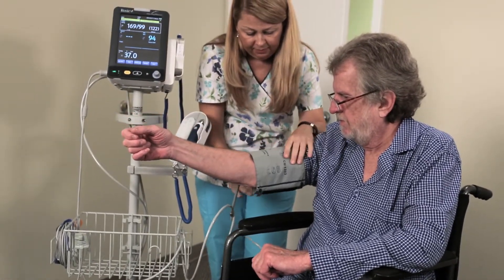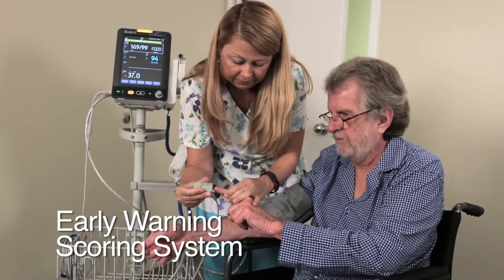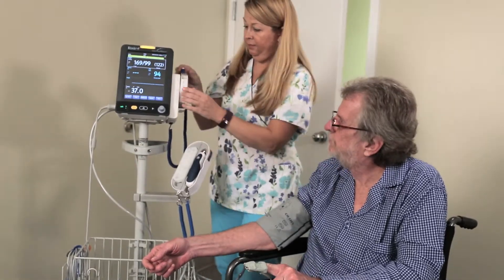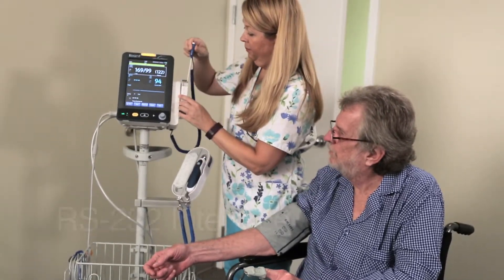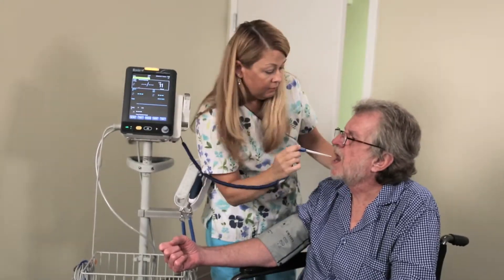Facilities will have the option to enter up to six additional vitals as well as an early warning scoring system that further assists in clinical decisions in your skilled nursing environment. The Rosie 4 offers RS-232 interface for third-party connectivity solutions.